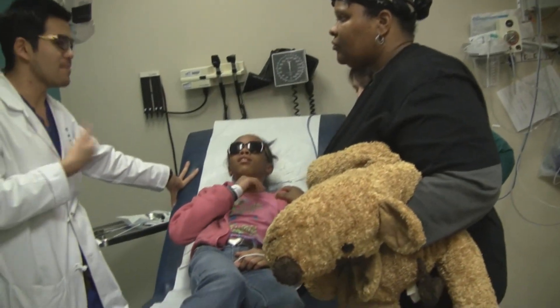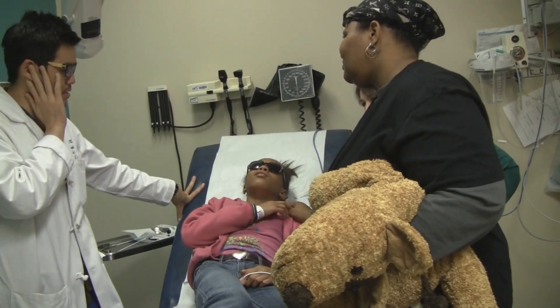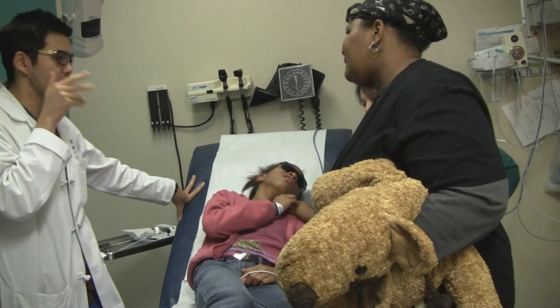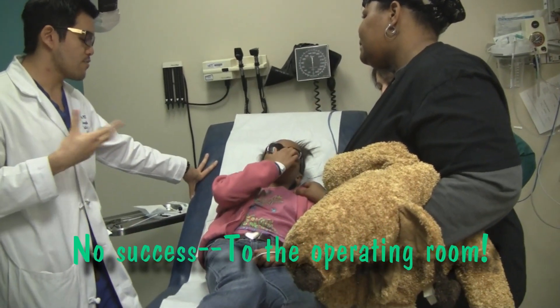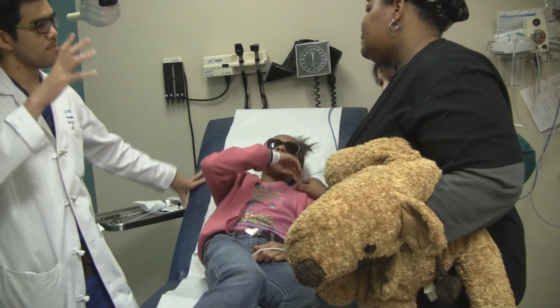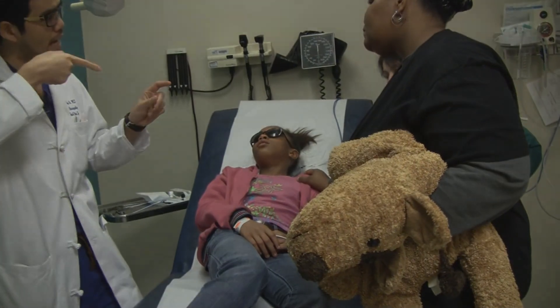It hurts — it's right up against the eardrum. You don't want to damage it by trying to get the alligators in there too far. Because when we do it in the operating room, I have a microscope so I can see and use my best depth perception. With this, you only have one eye.